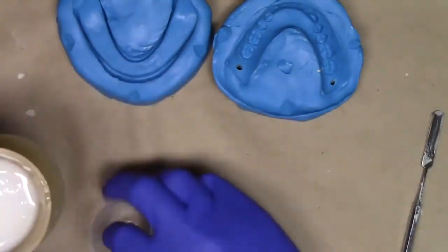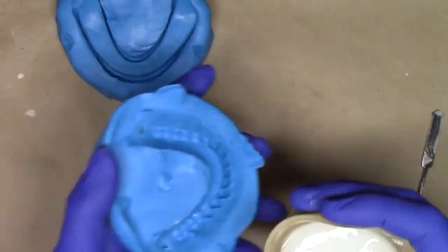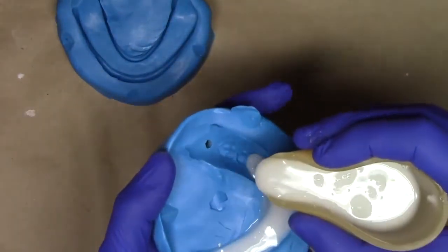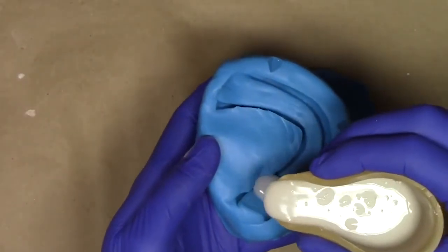Now at this point, what I'm going to do is take a little bit of monomer and paint it on the edge, and I'm going to pour some of this directly into my mold, just like so, and then also into this mold, just like so.